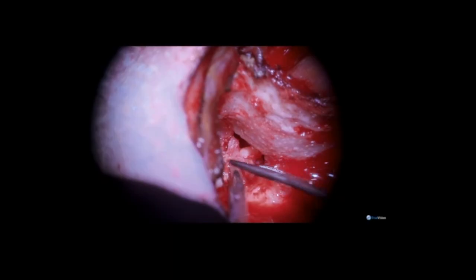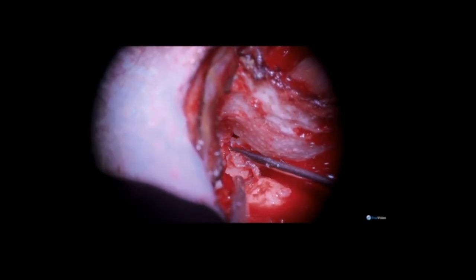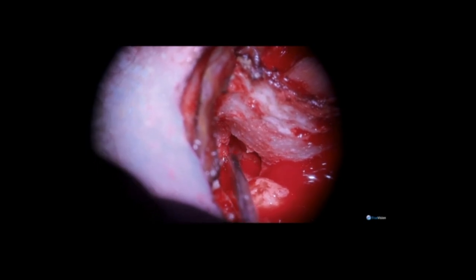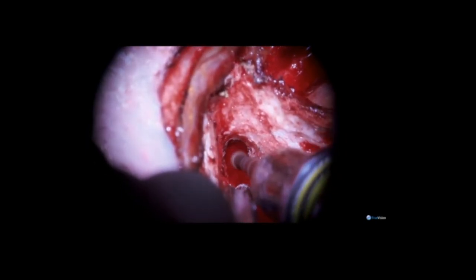Now I will remove the remainder of the disease and clean up with a diamond burr all the bony contact points.